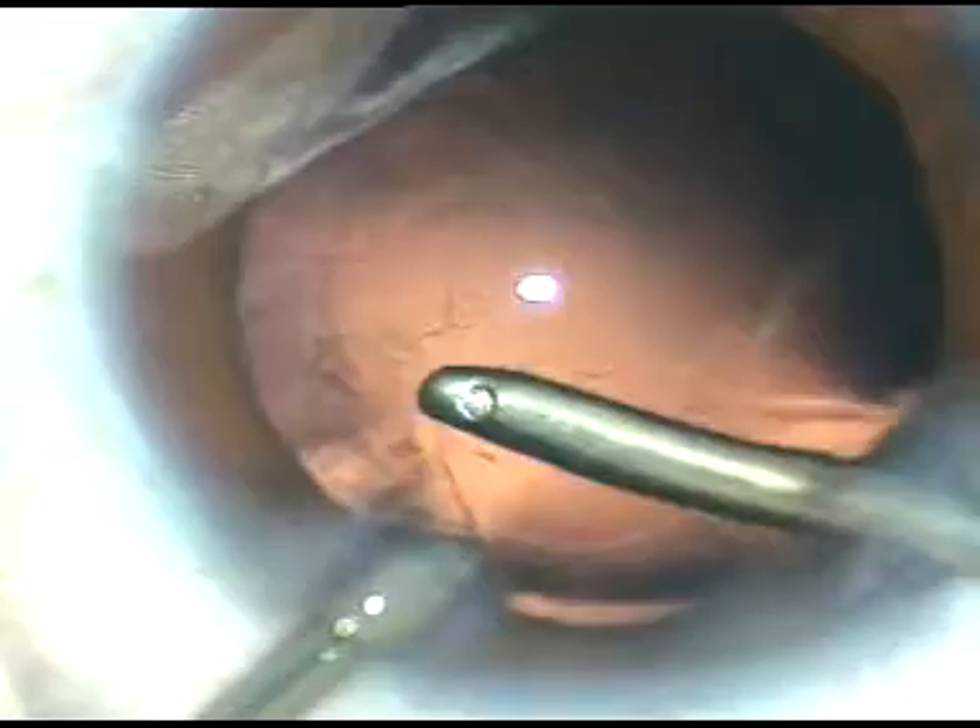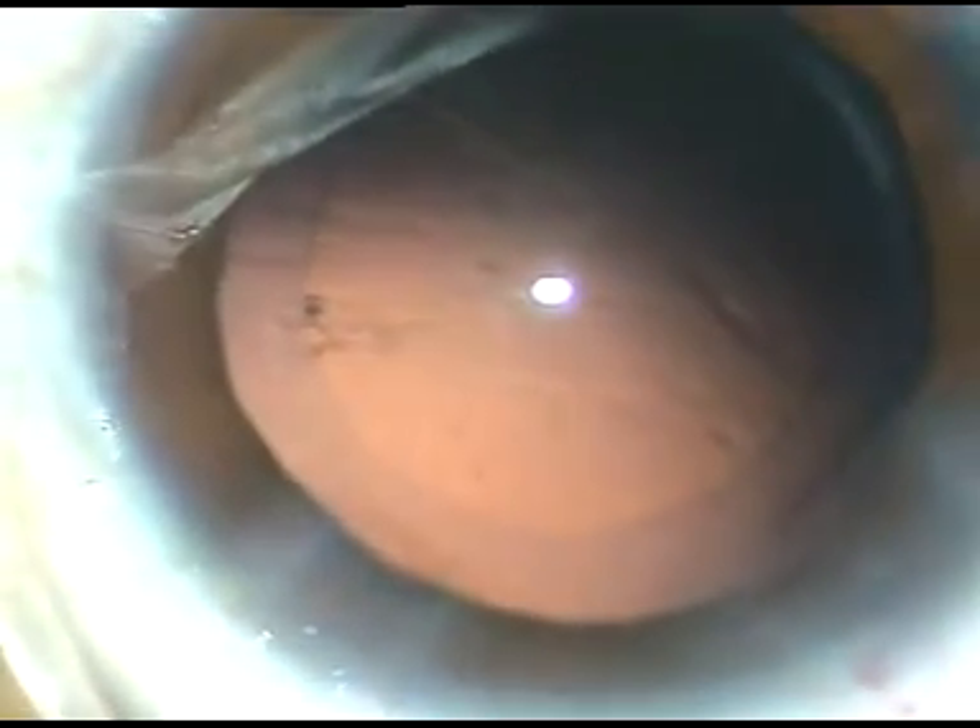Some fibers are there sticking to the posterior capsule. I am going to demonstrate hydro polishing with the help of fluid. I am just using the fluid jet to dislodge the cells and see how beautifully we can polish the posterior capsule. All the cells are getting dislodged and the posterior capsule is becoming clear. The left half has become clear. Now I am working on the right half and the posterior capsule has become very clear. No need to use irrigation aspiration or cap-back mode - just use the fluid jet, sweep it over the posterior capsule and we can have a nice polishing.